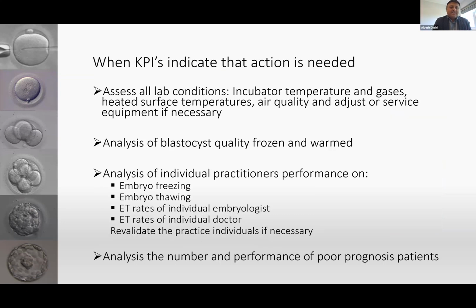So when does an embryologist need to take an action? Of course, when anything triggers in your KPIs. For example, if your survival rates of your blastocysts is not good enough, that's when you start digging deeper. Then what is the reason? I always call it finding the needle in the haystack, which is not easy. When things are working well, it's great. We take it for granted.